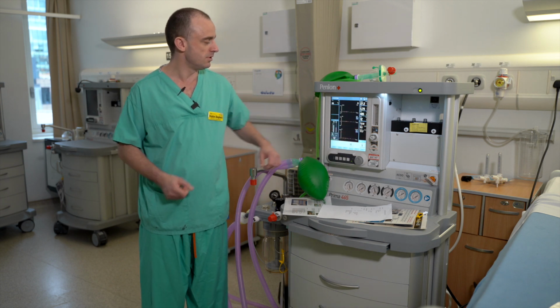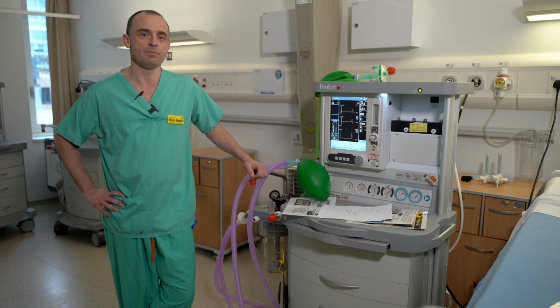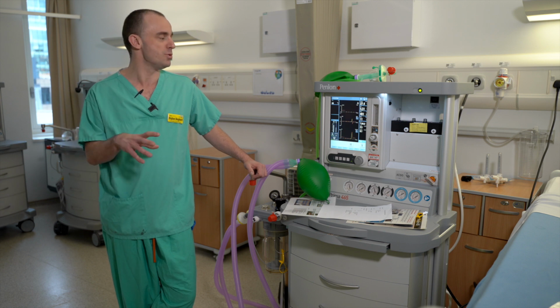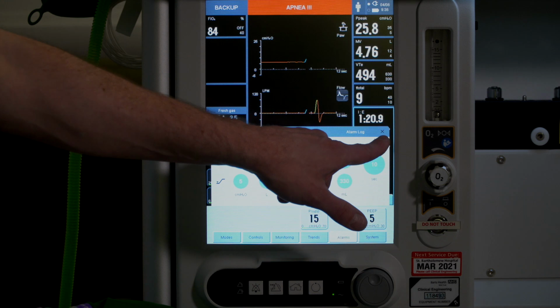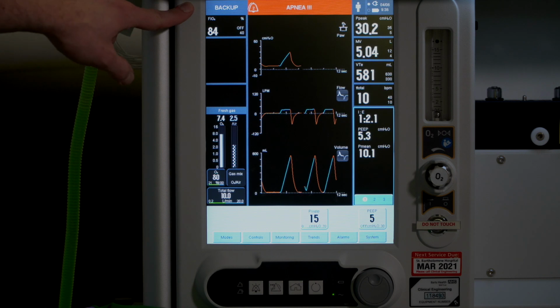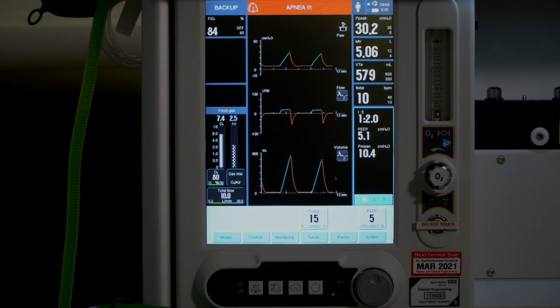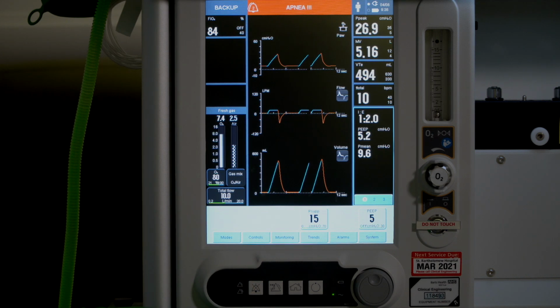You'll see as well, in this patient who's not breathing, the apnea time is set by the alarm. So it's not part of the setup of the mode, but it depends upon what you've set as your apnea time here within the alarm settings before the ventilator will kick in. You will also get an alarm which says apnea, and a comment which says that you're currently in backup mode. The alarm may not sound, but you can clear the alarm by pressing that button here.